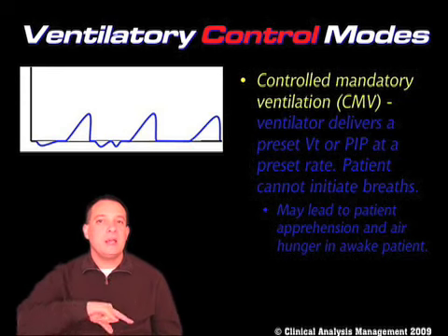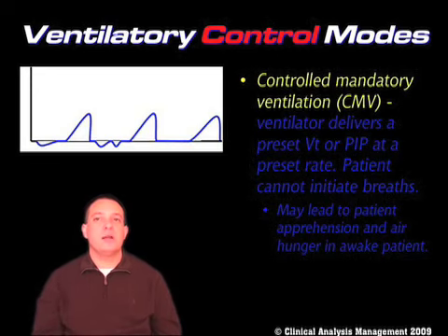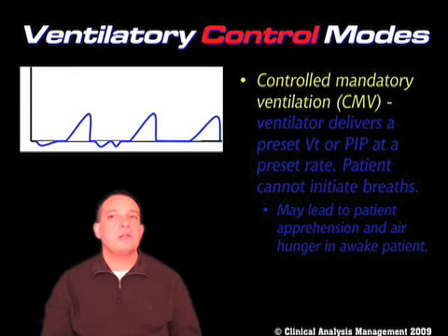That's not the way we breathe. We normally have 1 part inspiration for anywhere from 2 to 3 parts expiration. So when I'm taking somebody and I'm purposely flipping that, when somebody's in hypoxic respiratory failure, and I'm at the point where I've got to start thinking about inverse ratio ventilation, a lot of times we will put them into a control mode so that we do take over their respirations because we don't have any choice but to control them.